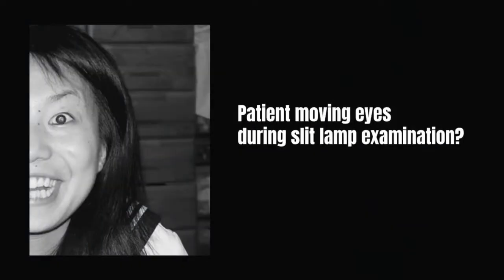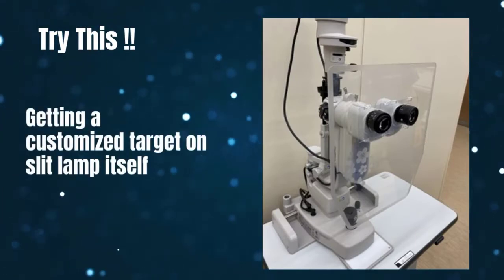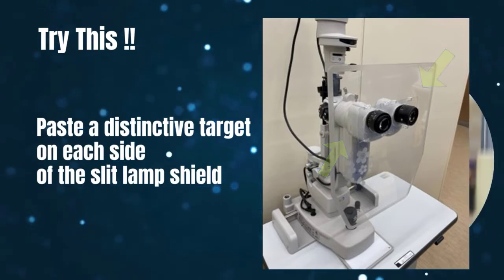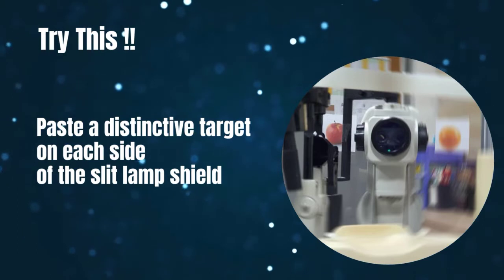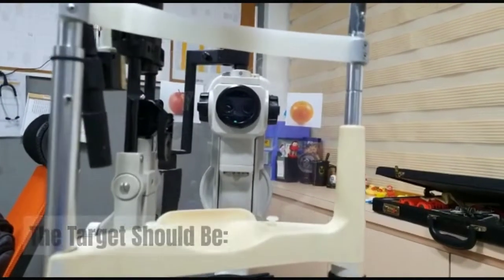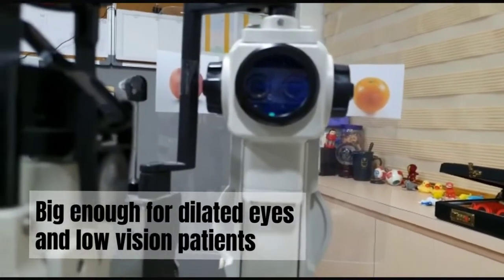Is your patient moving their eyes during slit lamp examination? How about getting a customized target on the slit lamp itself? You can paste a distinctive target on each side of the giant slit lamp shield that you have installed during this COVID-19 era. Here are some tips: the target should be bright colored, big enough for dilated eyes and low vision patients.